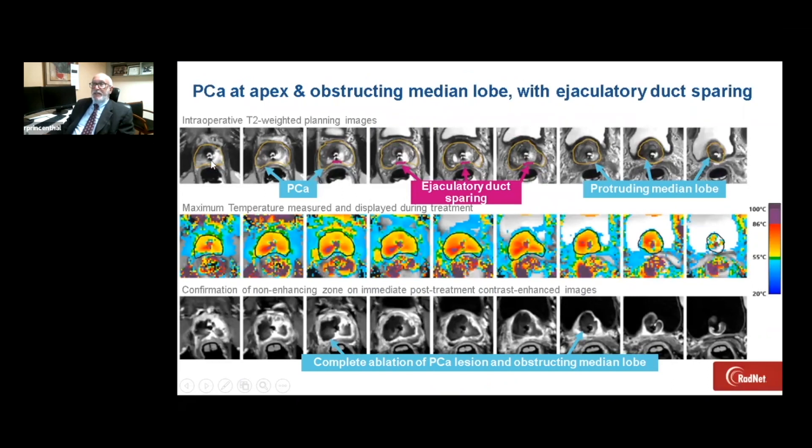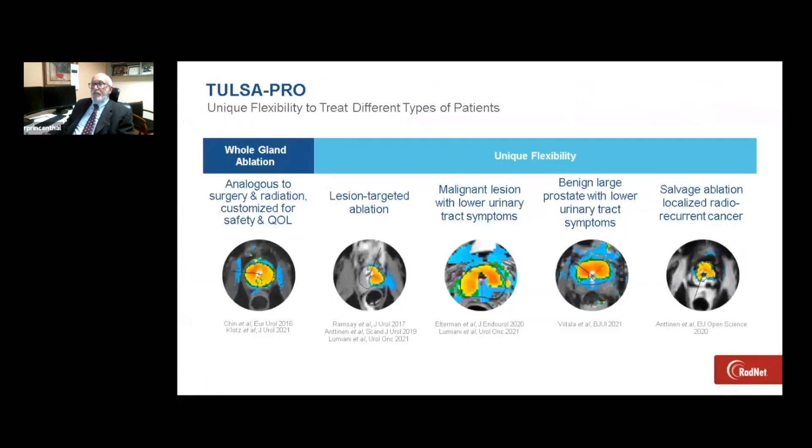In this patient, you can see that there is a cancer at the apex as well as an obstructing median lobe. We were able to successfully create a unique contour and treatment plan. You can see the heat maps here from the apex to the base down to the apex. At the conclusion of the study, you can see complete thermal ablation with vascular coagulation and no perfusion.